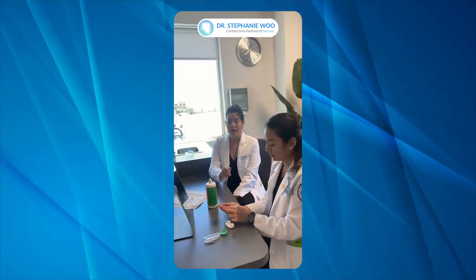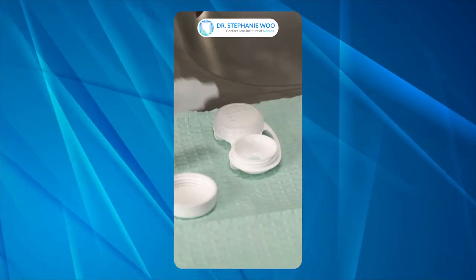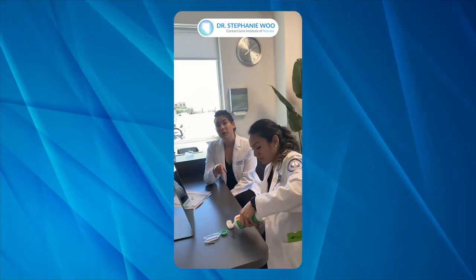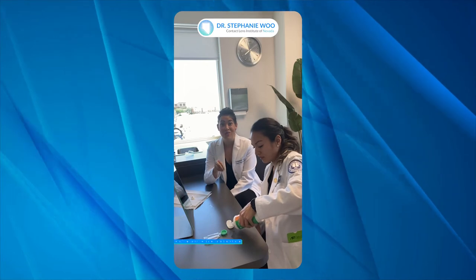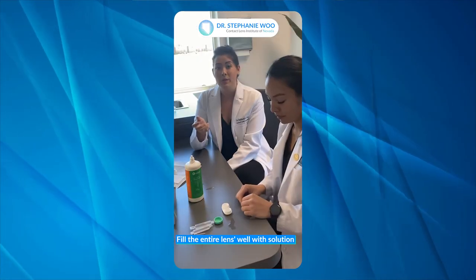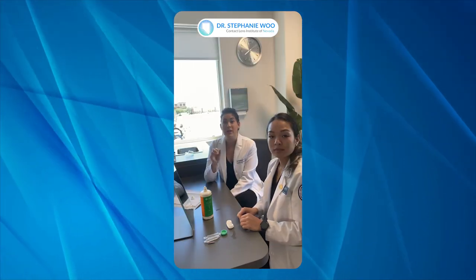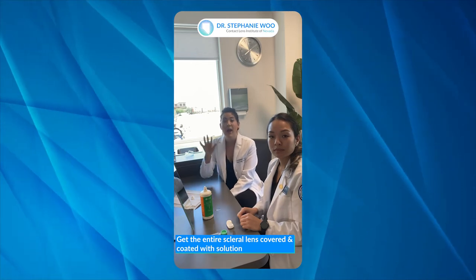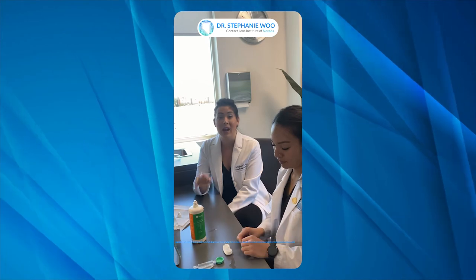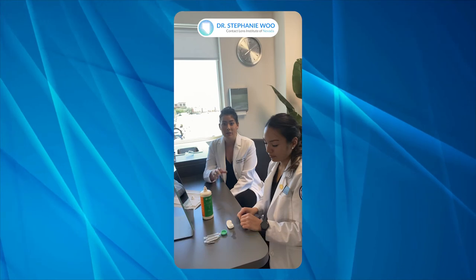Now she's going to place the lens into the lens well and fill the bowl of the lens well with multipurpose solution. It's really important that you fill the entire lens well with solution. Sometimes patients don't fill it enough. You want to make sure the entire scleral lens is covered and coated with solution, which ensures the entire lens is going to get properly disinfected and cleaned while it rests.